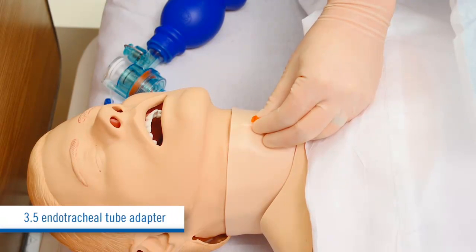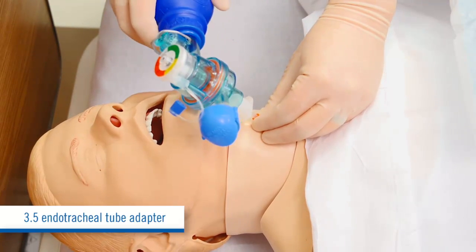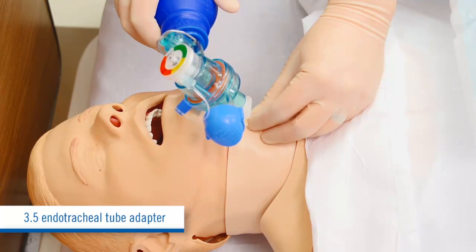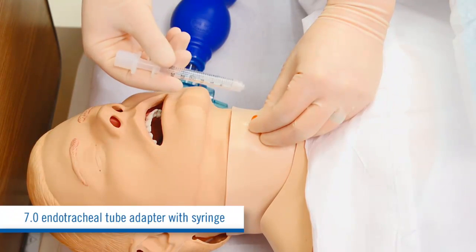Number 1, a 3.5 endotracheal tube adapter. Number 2, a 7 endotracheal tube adapter with syringe.